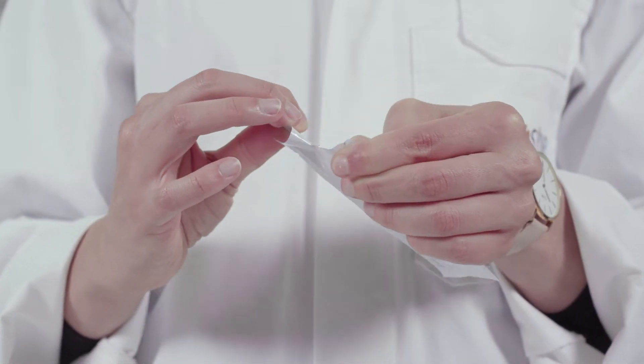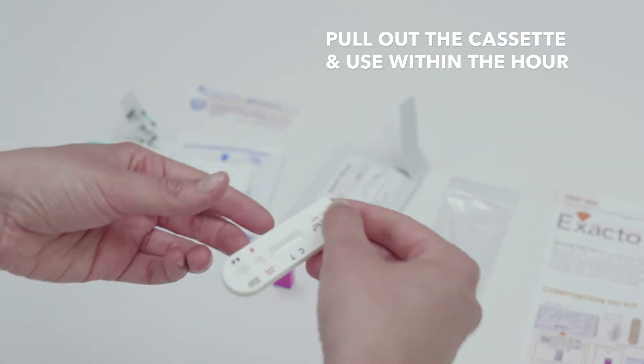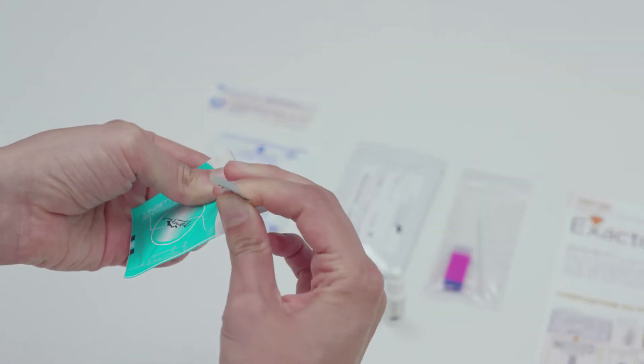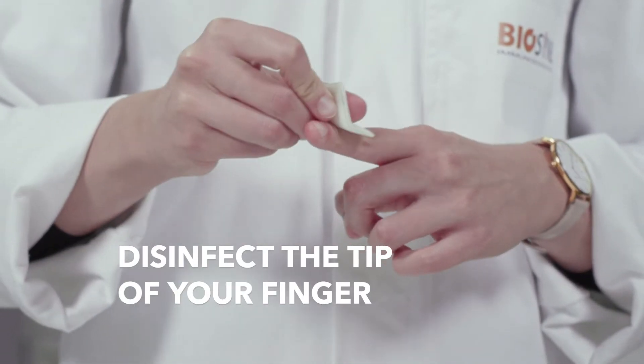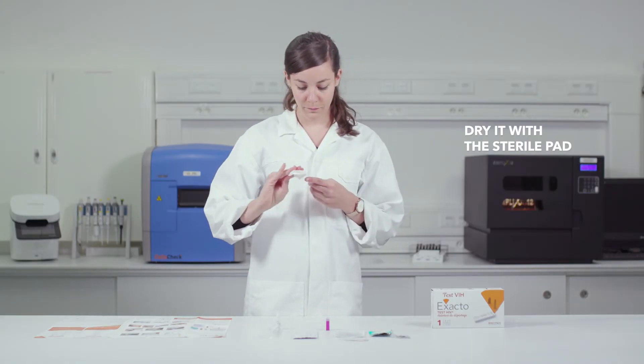Open the pouch and take out the test cassette. You will need to use it within one hour after opening it. Open the alcohol wipe and the sterile pad. Disinfect the tip of your finger with the alcohol wipe. Dry off any excess moisture with the sterile pad.